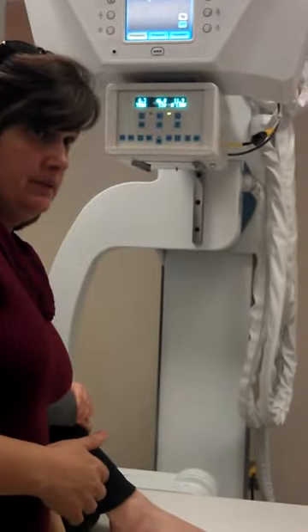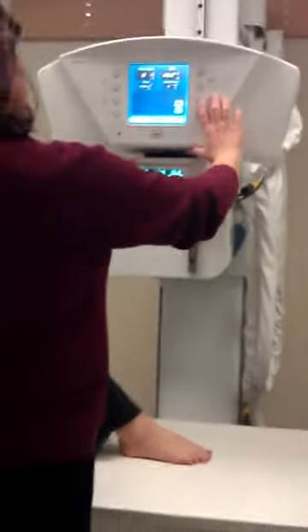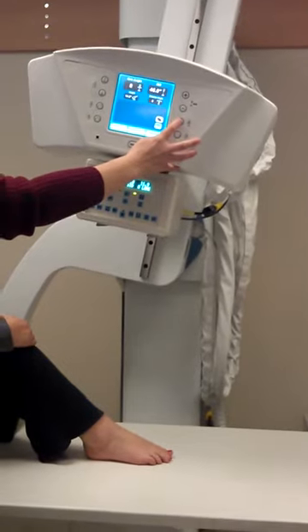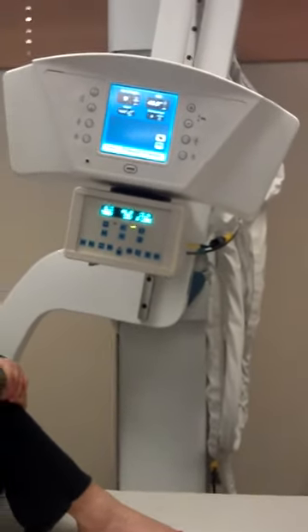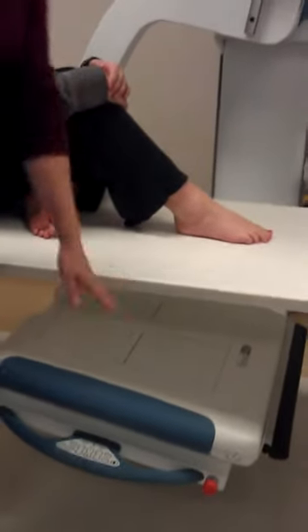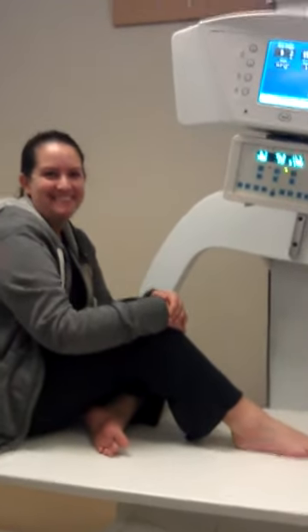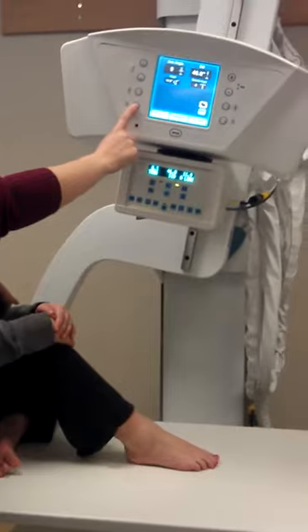There is an angle. What you have to do is lower this down. Because when you angle this, we have to pay attention back here. Now we have our angle — but you see, this is crooked. So now we have to flatten this out. If we did not lower this whole thing, this would tilt into the table, and then it would say error, movement, and you'd have to get your patient off the table, move the table off of this thing, and then it will reset itself.